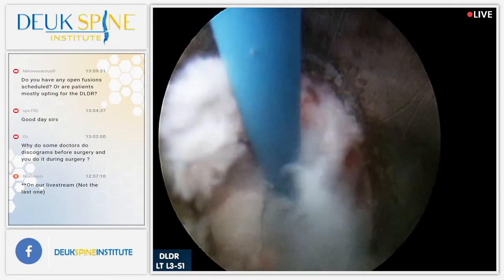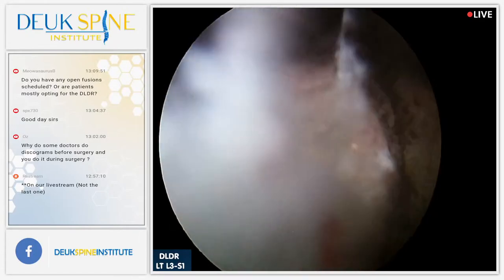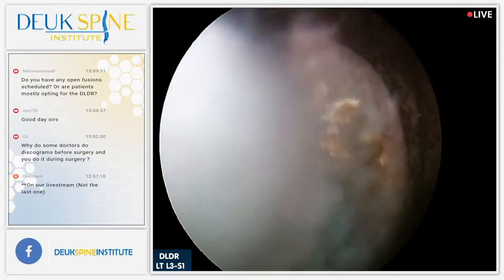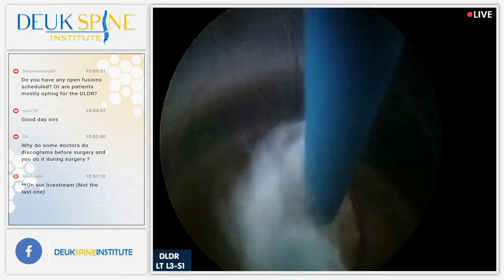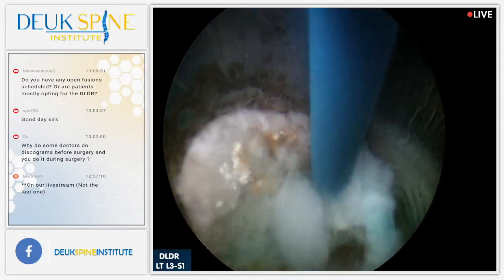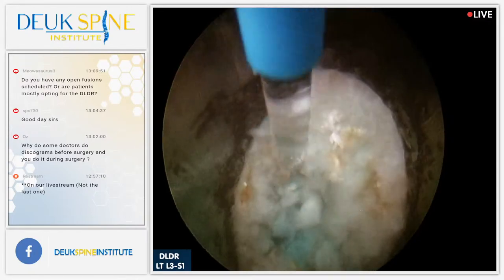Great question, Oz. The reason is because the discogram is a really nice test to figure out whether or not a disc is causing pain. And the truth is that I'm pretty darn good at figuring that out without doing the discogram. So when I get in here during surgery and I do a discogram, it's not because I'm not sure if the disc is causing pain or needs surgery. It's because I just like to confirm it. Since we're here and we had to put a needle in there anyway to get the guide wire in, you're already set up for it. Plus, we use not just discogram dye in the dye, we actually use some numbing medicine. So no matter what, I'm doing a discogram every single surgery.